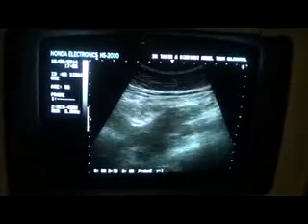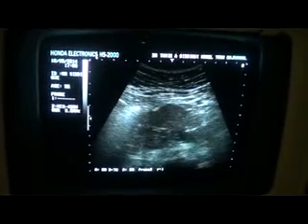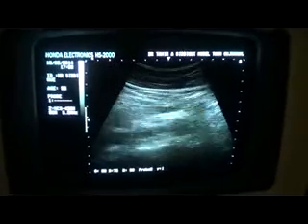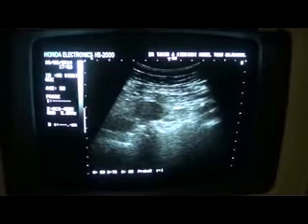This is the retroperitoneal mass which encases the aorta. This is the aorta, and this is the retroperitoneal hypoechoic solid mass with no internal calcifications in longitudinal section. There is another lymph node in the left para-iliac region — these are the iliac vessels.